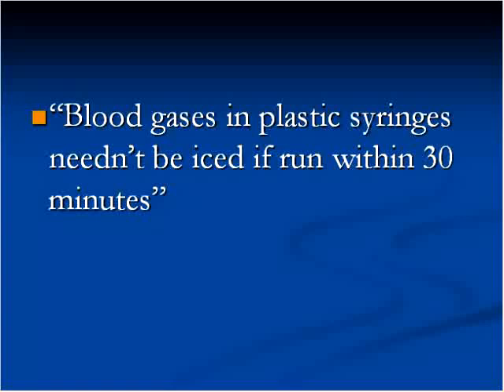And of course, the reason this happens, oxygen will typically increase in the sample because the oxygen in the room is roughly 150 millimeters of mercury, depending on humidity and altitude, etc. But it will usually increase.